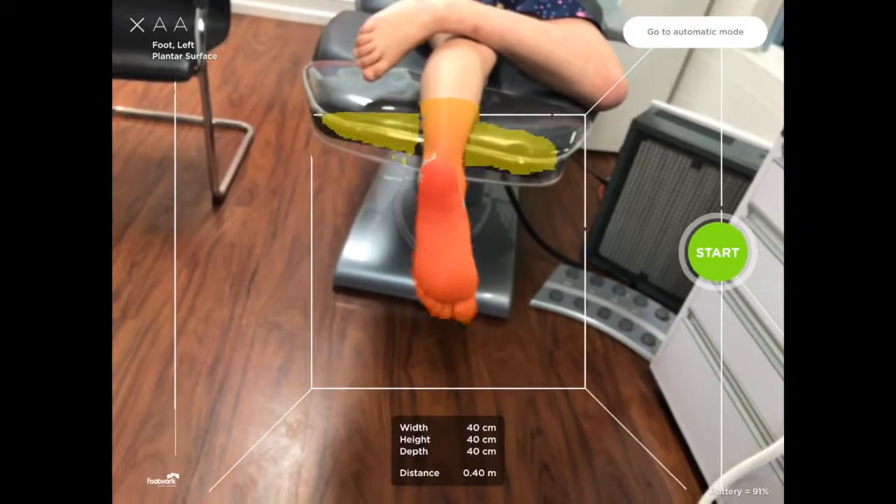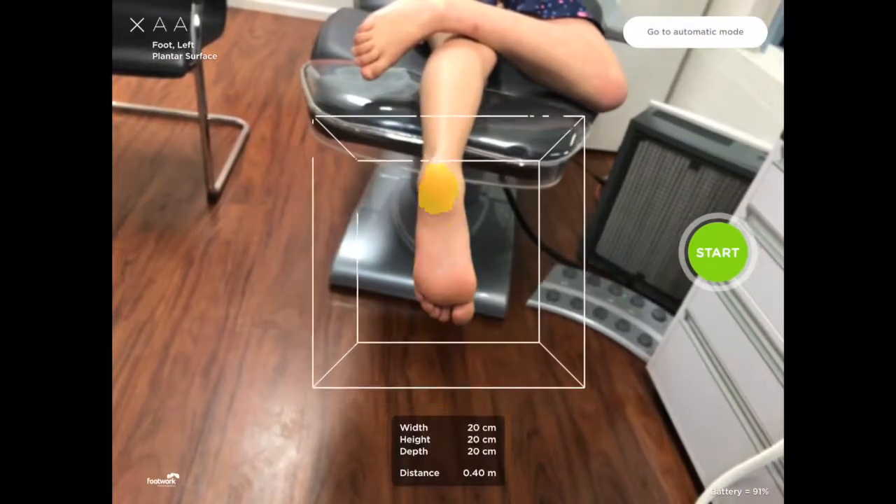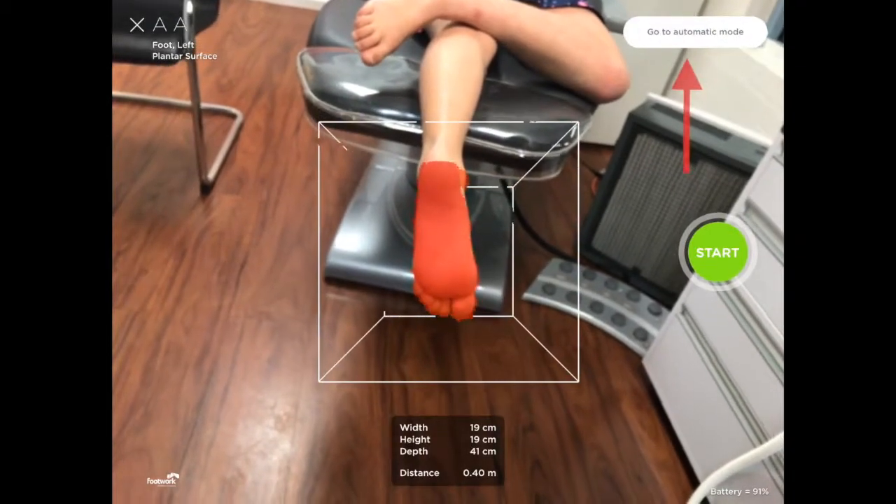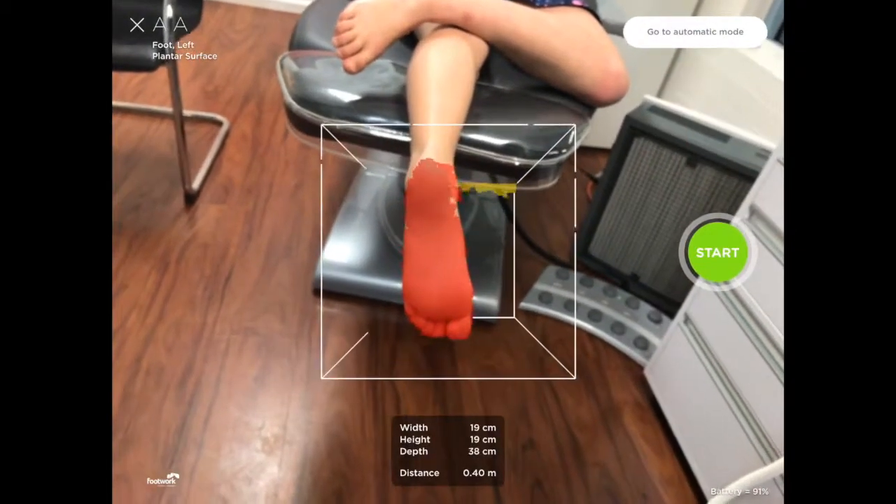When you click it, you can now adjust the scanning area including the scanning depth, and you can return back to the automatic option by clicking 'Go to Automatic Mode'.